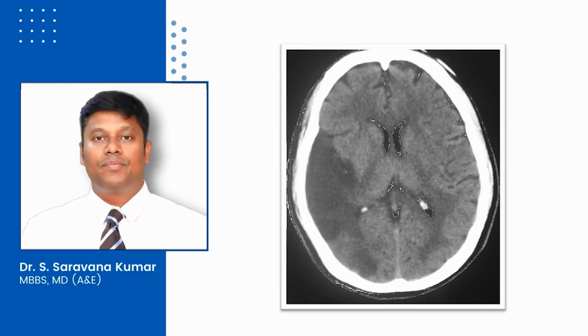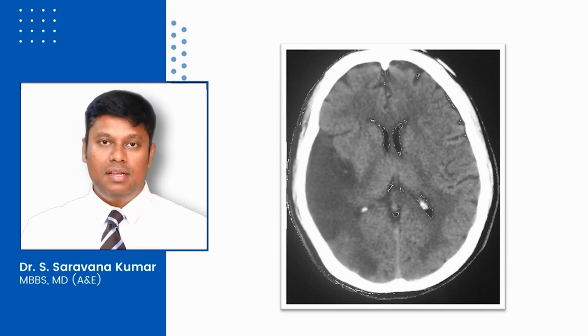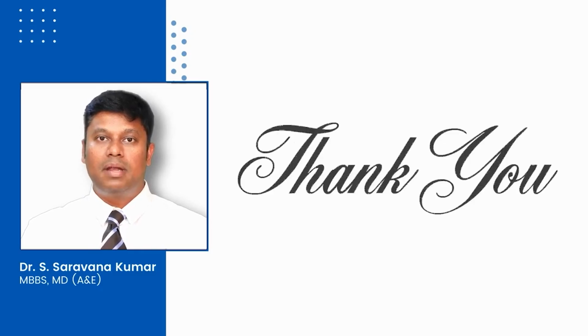So with this we conclude this topic, and I hope you find it easier to first identify the anatomical regions of the brain in the CT scan, and then you can look into the abnormality and which location it is.